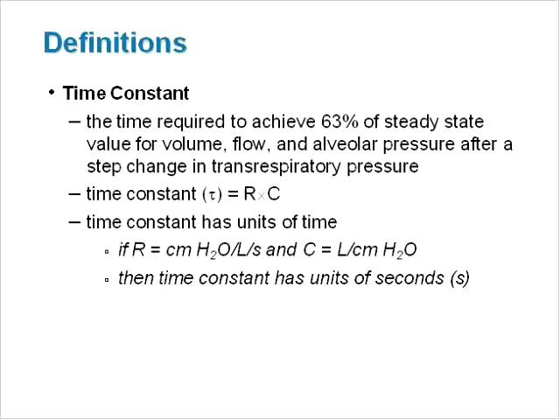Respiratory system mechanics determine the speed of filling and emptying of the passive respiratory system. This concept is particularly important when we talk about BiLevel modes. A convenient index of the speed of emptying or filling is the time constant. A time constant is the time necessary for the passive respiratory system to empty or fill by 63% in response to the pressure rises or releases during mechanical ventilation. Mathematically, the time constant is calculated as the product of resistance and compliance and has the units of time, usually in seconds.